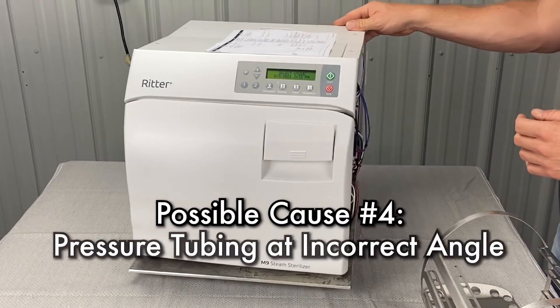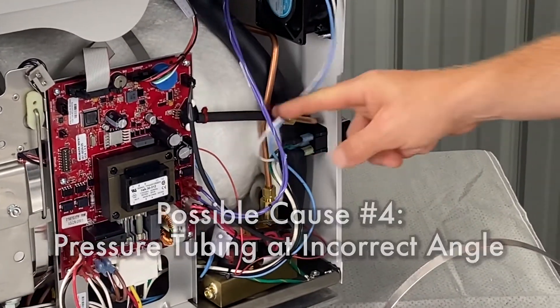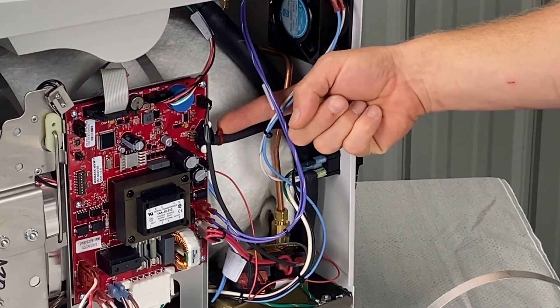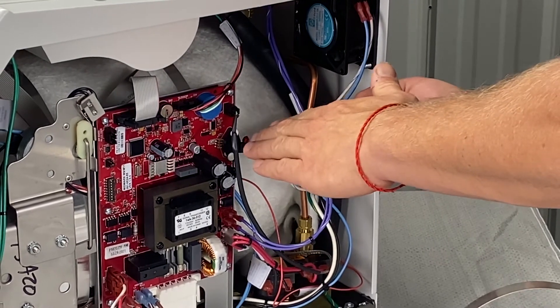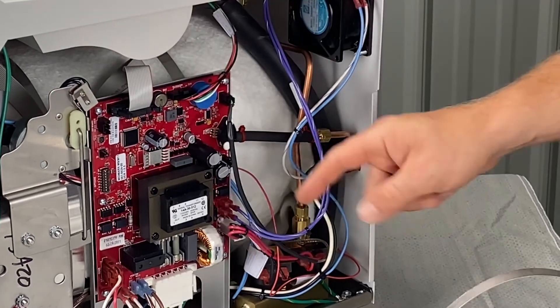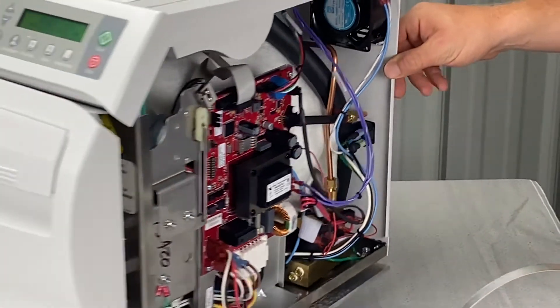It could also be that the pressure tubing is at an incorrect angle. The pressure tubing is right here — this is how you want it. You don't want it high up like that because water will flow back towards the pressure sensor, especially when there's no pressure in the chamber, and that could cause a faulty reading. That's your pressure sensor right here. Take the left or right side panel off and make sure the tubing is pitched correctly.